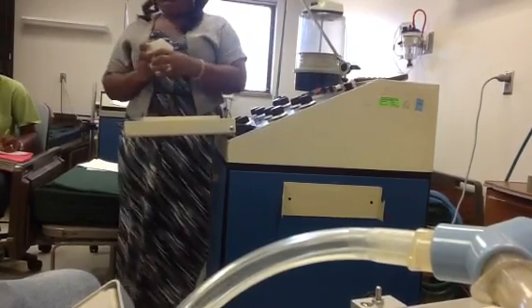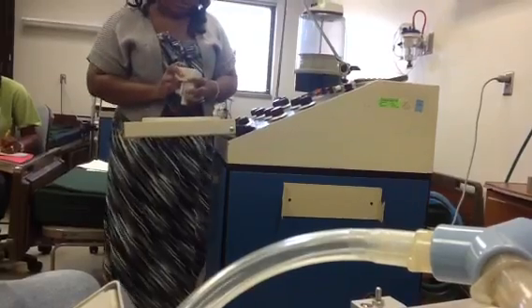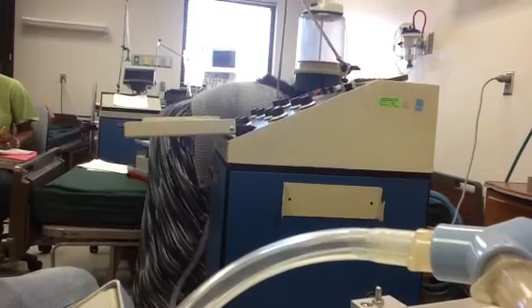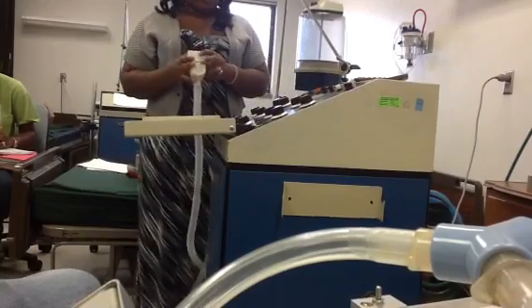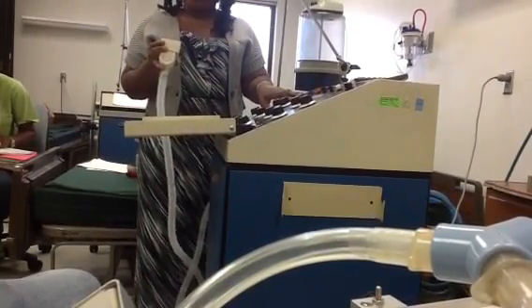How do you measure tidal volume? So, again, from the water trap to your right, it gives a breath. And I have it on hold.